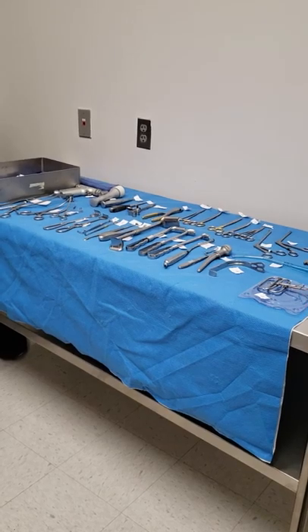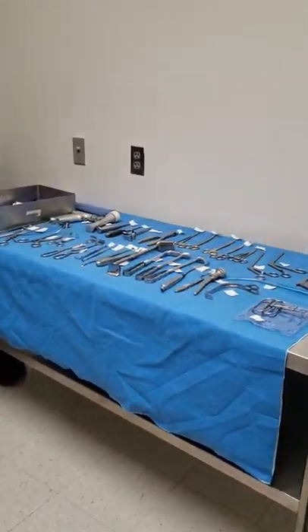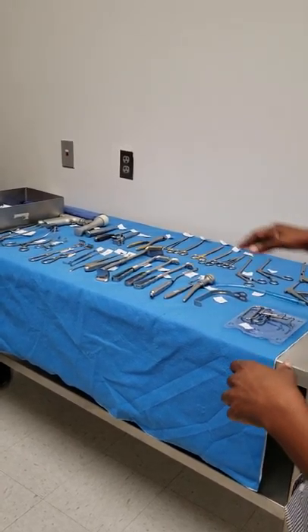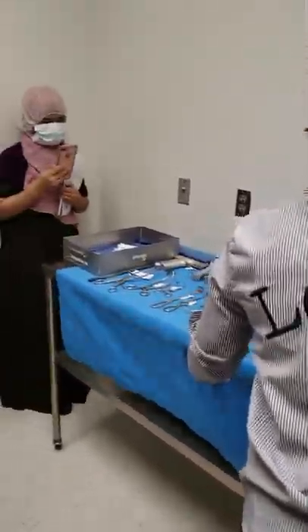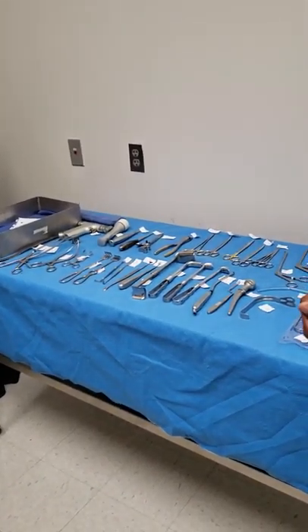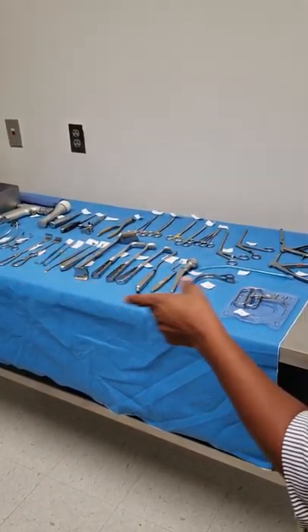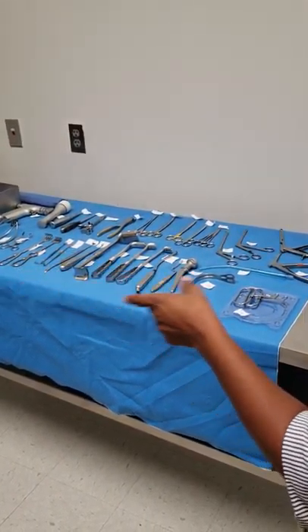So you gather your supplies first, right? Mm-hmm. So I want to gather all my supplies. I came in the room. The second thing you do is put the items where they're going to be opened. So if I know my gown and gloves are going to be open on my mayo stand, am I going to put it on the table over there? No. I'm going to place the items where they're supposed to be open. I'm going to place my rings, my instruments on my ring stand.